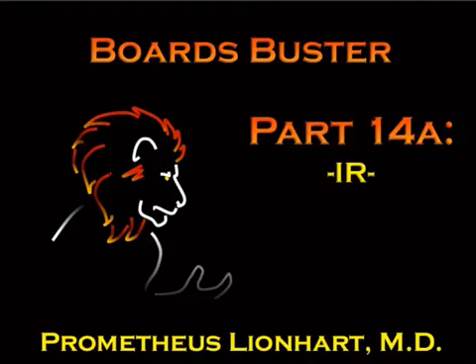All right, so this is our IR talk. It's just an introductory talk. Going to cover some general vocabulary words, like what is a French. We're going to talk about some basic angiogram anatomy, and going to talk about stents briefly and IVC filters.